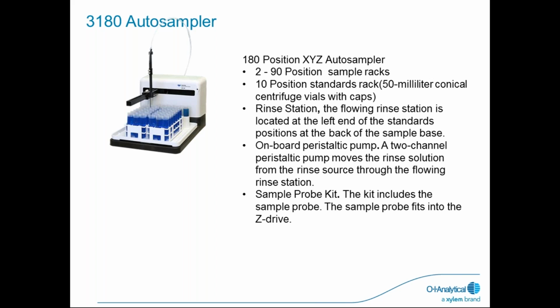Onboard peristaltic pump, a 2-channel peristaltic pump, moves the rinse solution from the rinse source through the flow rinse station. Sample probe kit. The kit includes the sample probe. The probe fits onto the Z drive of the autosampler.